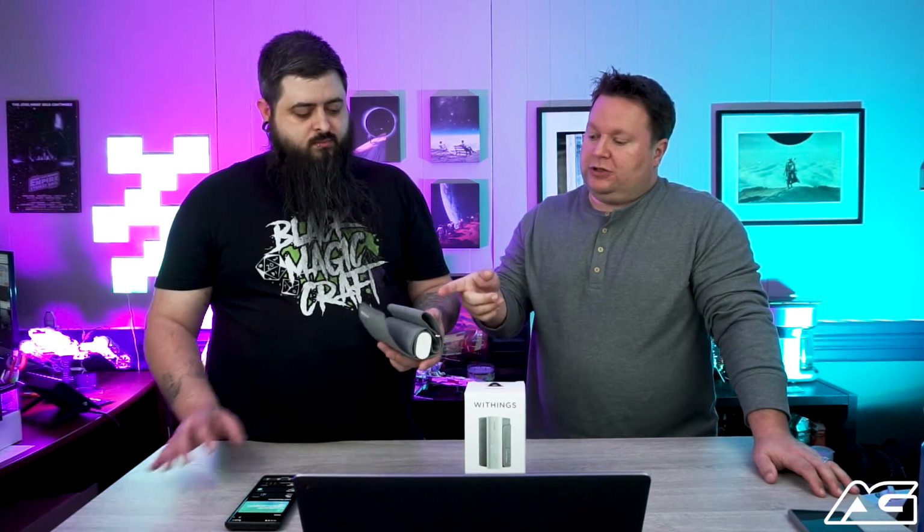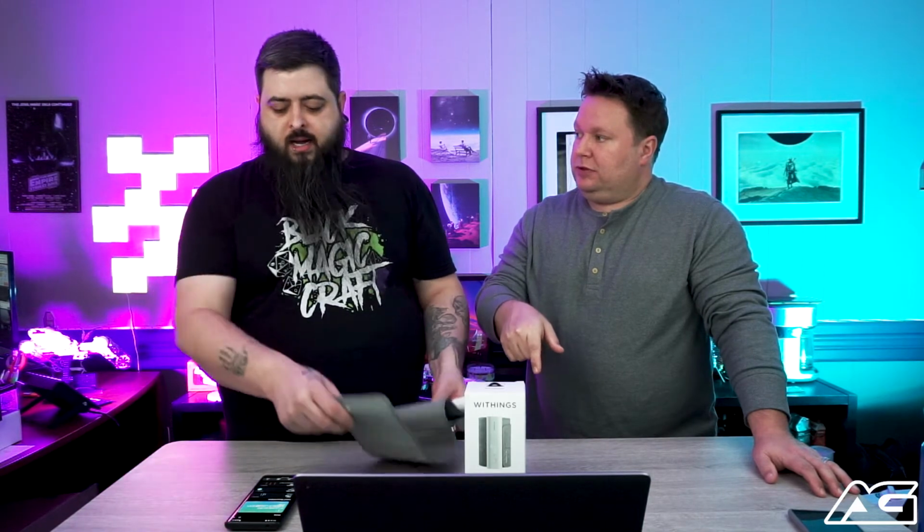Now, does it show the charge in the app? When you go into your devices, it does show the charge when it was synced. As of 2 hours ago, it's at a little under 90%. So it looks like it doesn't take that much energy to run it.